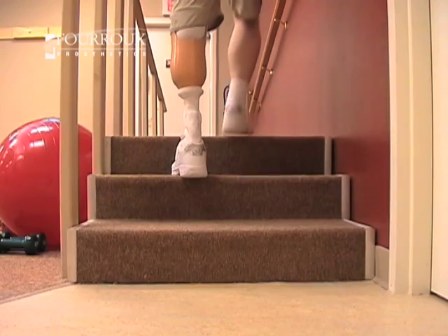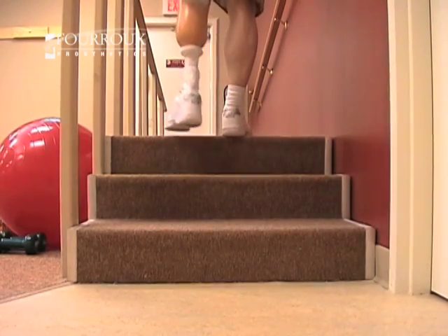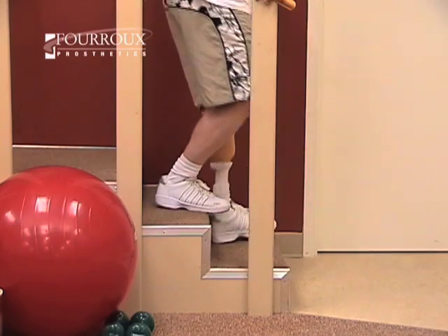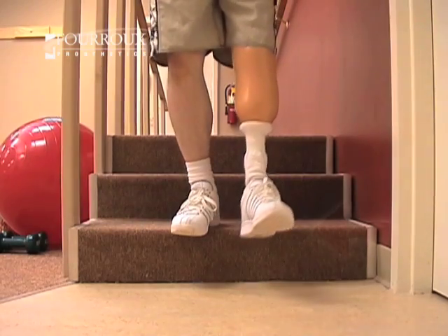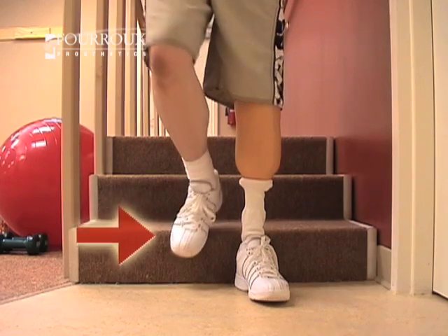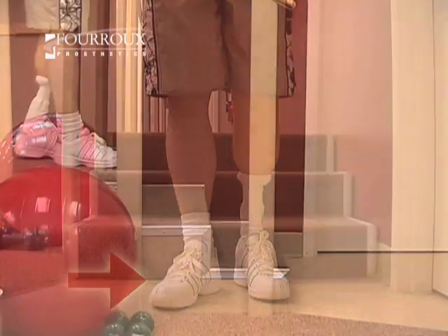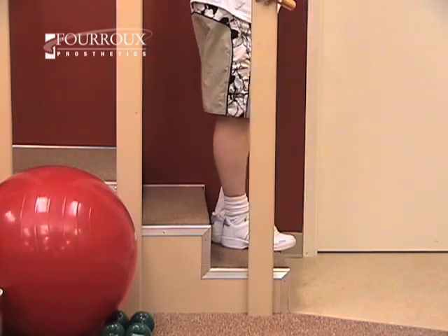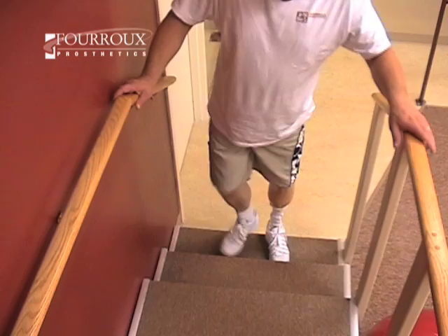Do not walk step over step, as this may cause you to lose your footing. You'll walk down the stairs in a similar way. This time, start with your prosthesis. Then, once you have control, bring your sound limb down to the same step. Repeat this — prosthesis, then sound limb — for each stair. Practice using the handrails, but work toward walking without them.